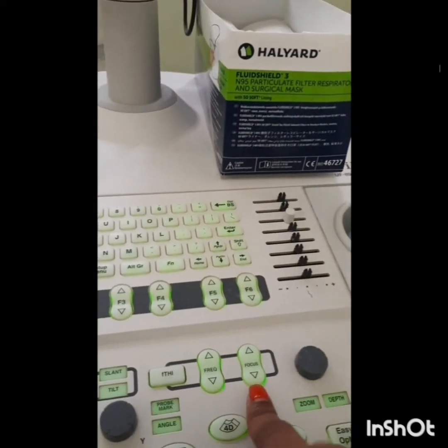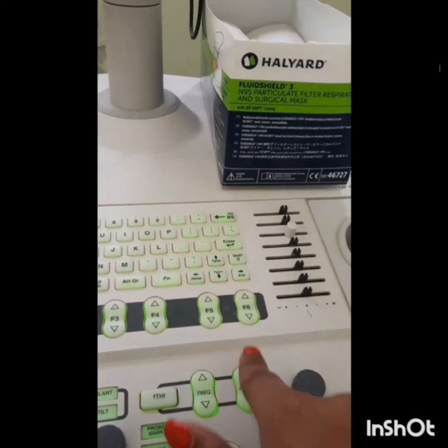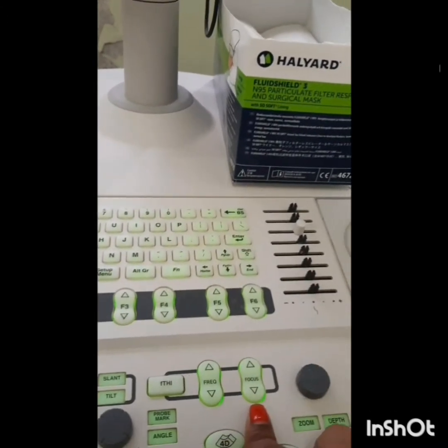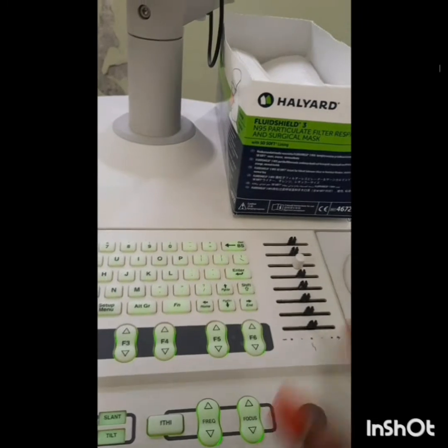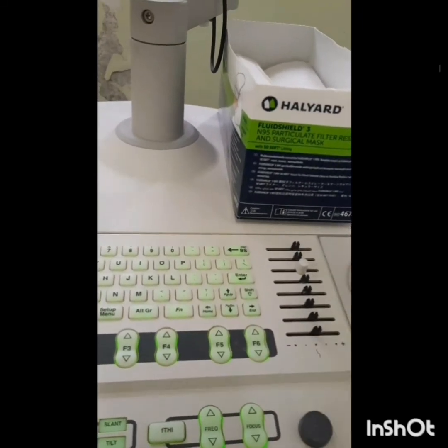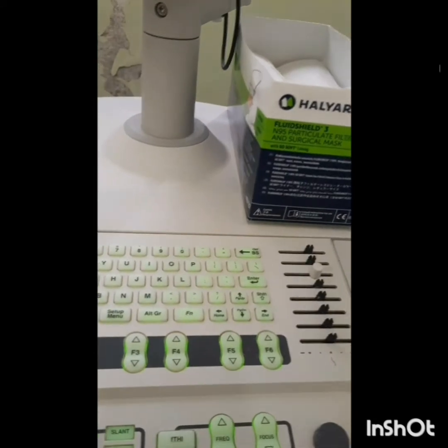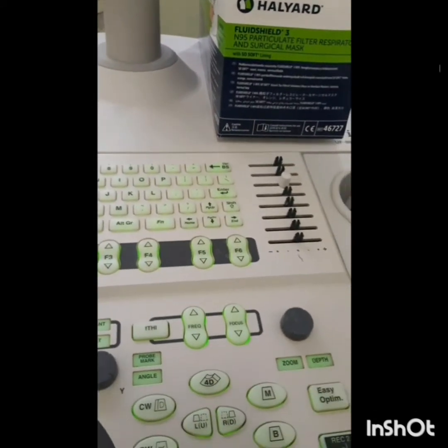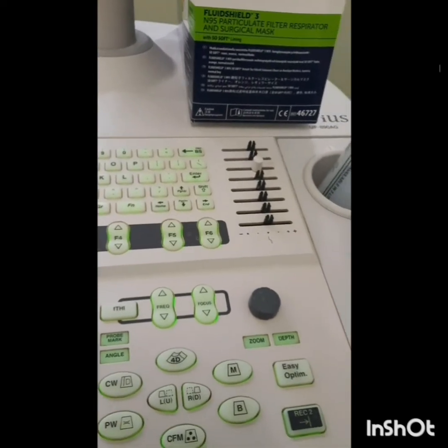And then this is the focus, where you're going to be adjusting your focal point when you're looking at the anterior aspect of the globe, as well as when you are assessing the posterior part of the globe, where you're going to be looking at the optic nerve.